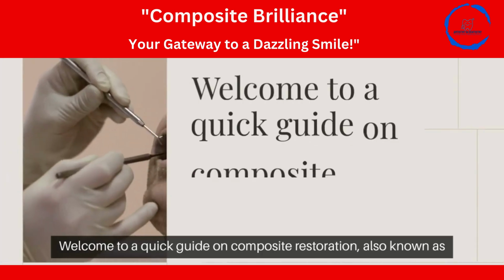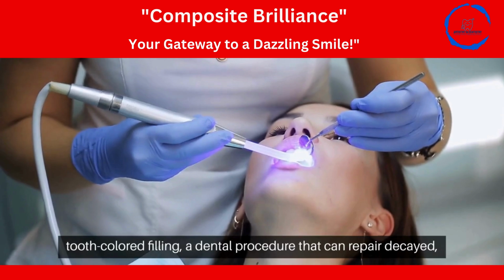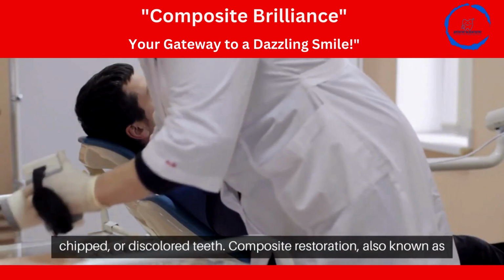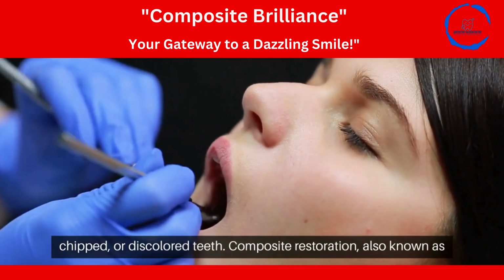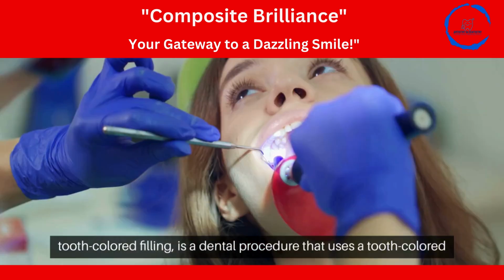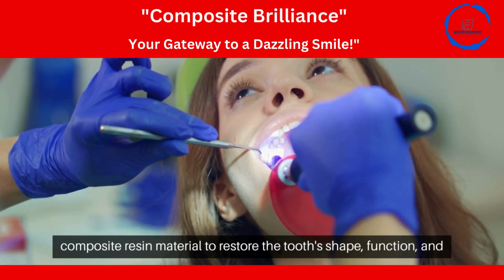Welcome to a quick guide on composite restoration, also known as tooth-colored filling, a dental procedure that can repair decayed, chipped, or discolored teeth. Composite restoration, also known as tooth-colored filling, is a dental procedure that uses a tooth-colored composite resin material to restore the tooth's shape, function, and appearance.